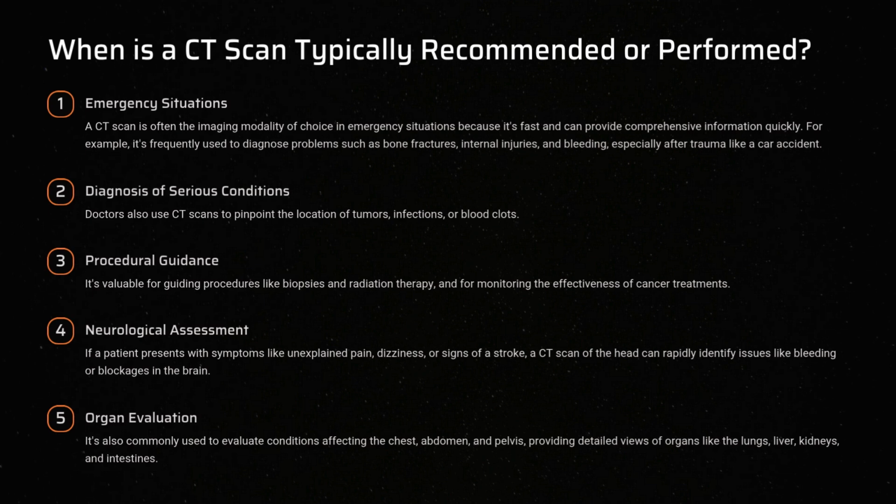When is a CT scan typically recommended or performed? So, when do healthcare professionals typically recommend or perform a CT scan? A CT scan is often the imaging modality of choice in emergency situations because it's fast and can provide comprehensive information quickly. For example, it's frequently used to diagnose problems such as bone fractures, internal injuries, and bleeding, especially after trauma like a car accident. Doctors also use CT scans to pinpoint the location of tumors, infections, or blood clots. It's valuable for guiding procedures like biopsies and radiation therapy, and for monitoring the effectiveness of cancer treatments.